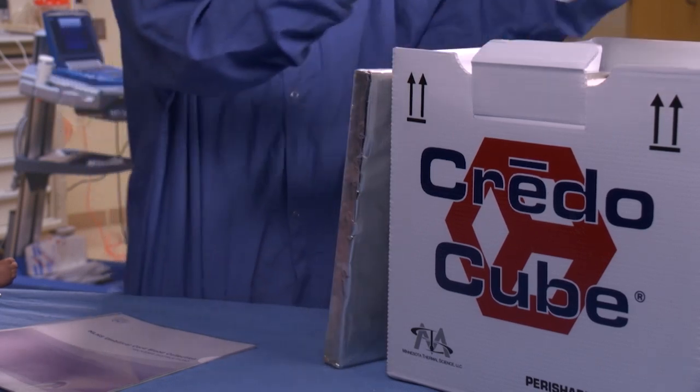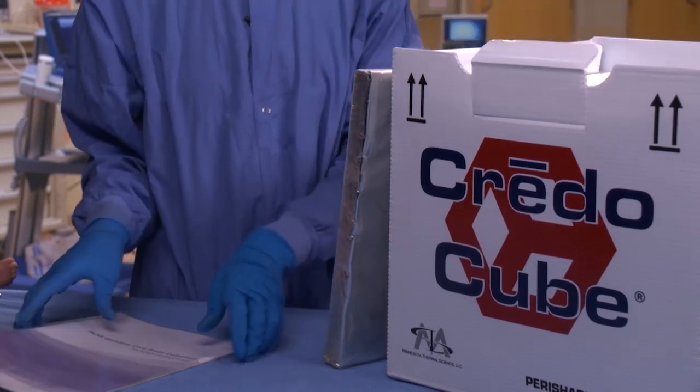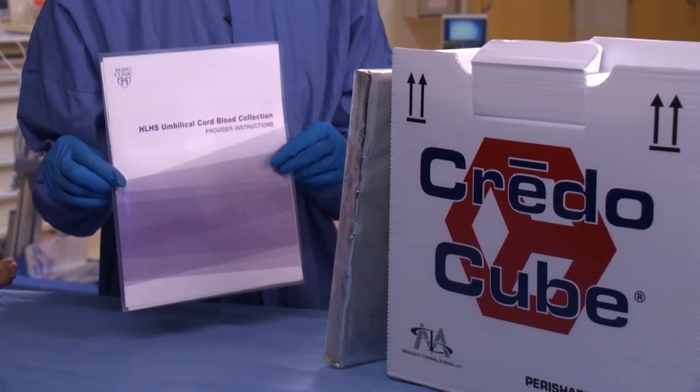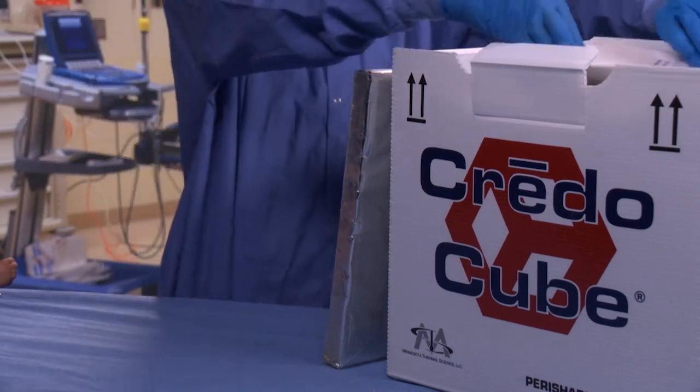Last but certainly not least, included in the cord blood collection kit is a provider checklist. Please review it, sign it, and return it back to the parents with the cord blood.